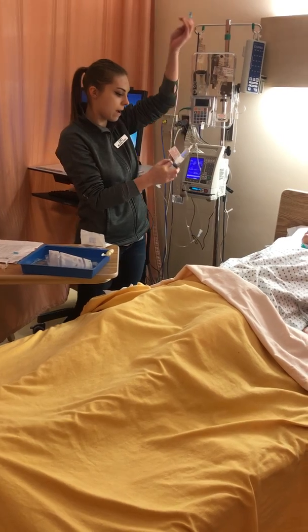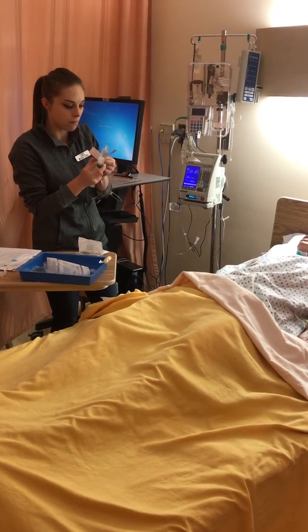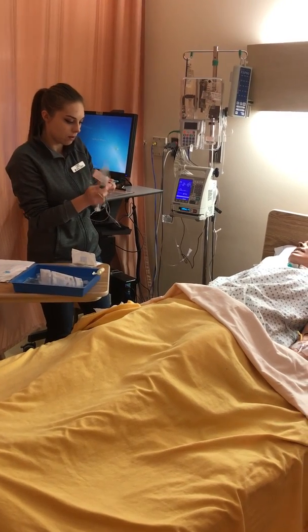So now I'm going to clamp it, so just in case I depress the plunger, I'm not losing any medication.